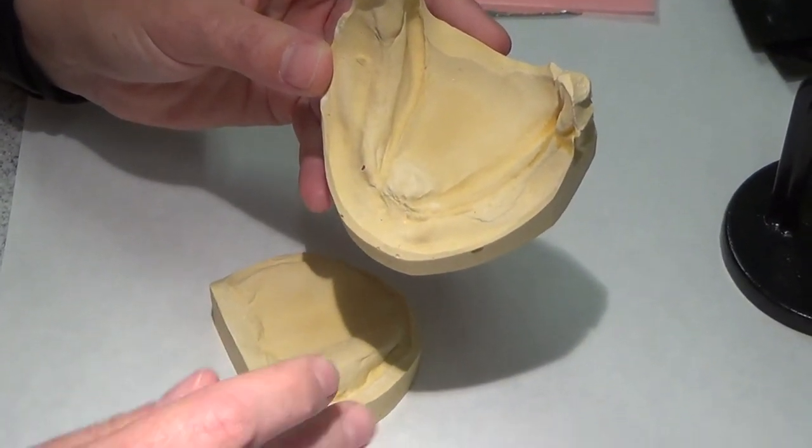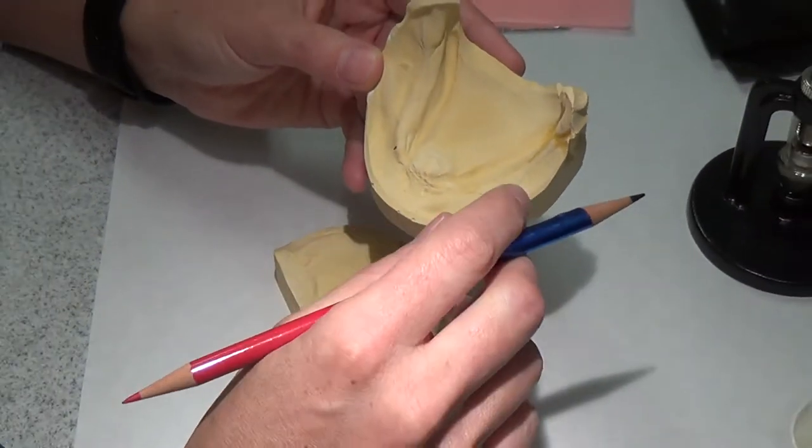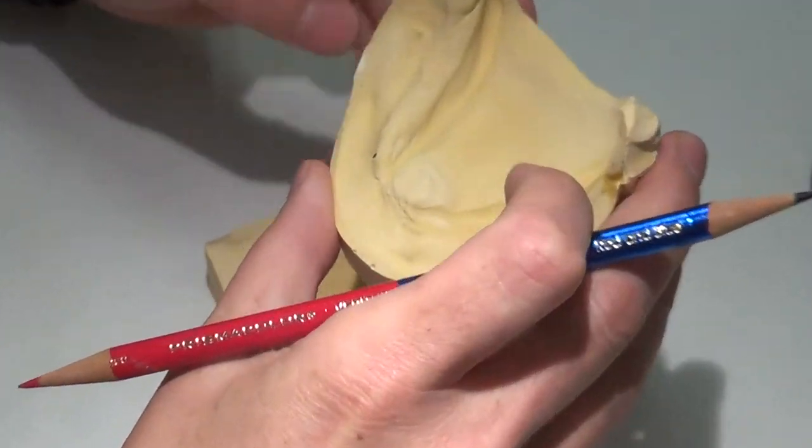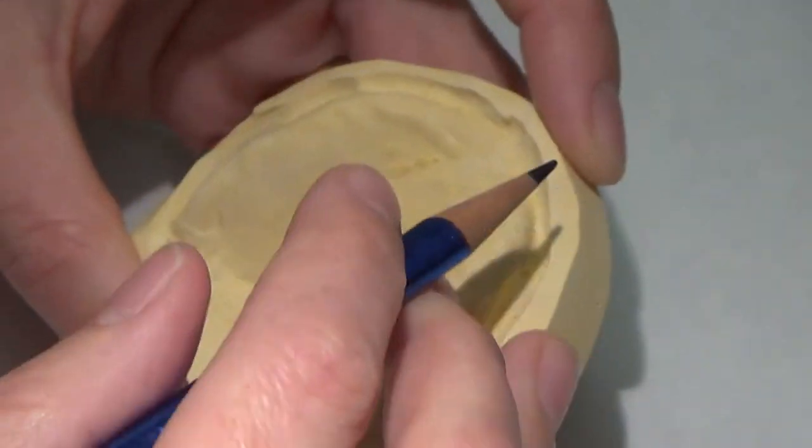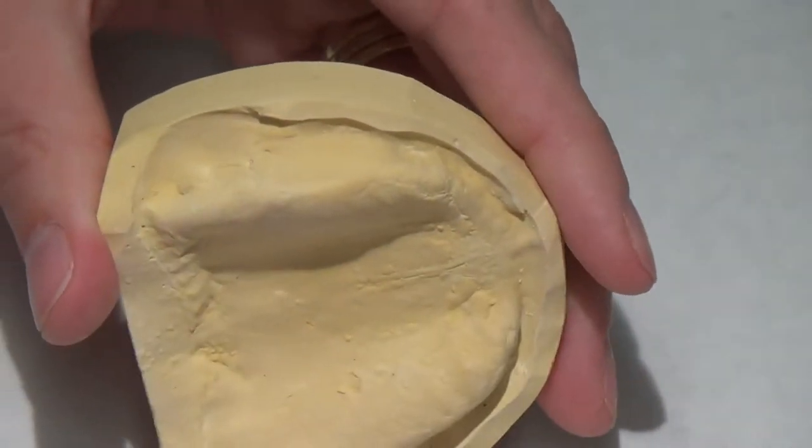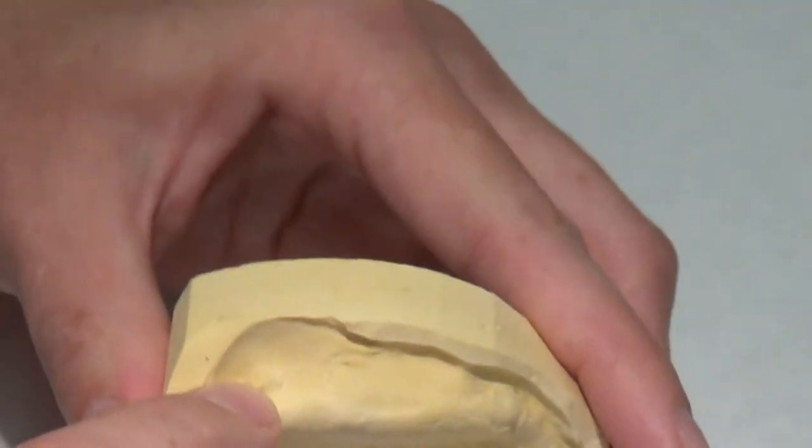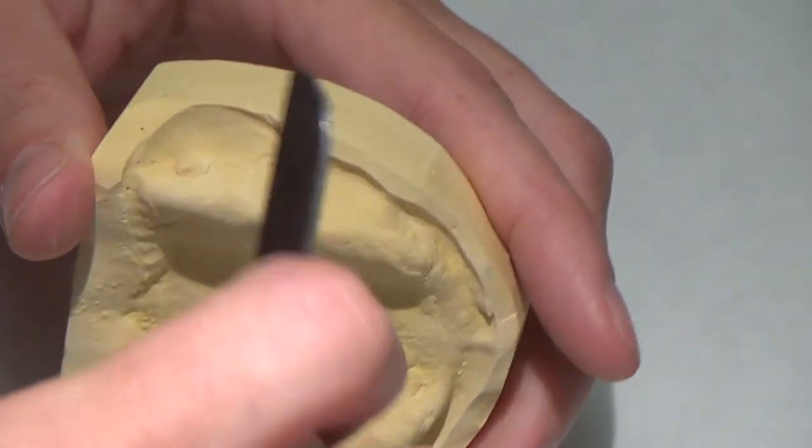So the first thing I'm going to do is come in and mark these casts. I'm going to start with the maxilla and I'm going to go around this bleb right here. Something I don't love. I'm going to go ahead and get rid of it.